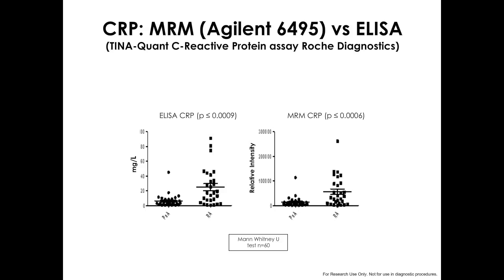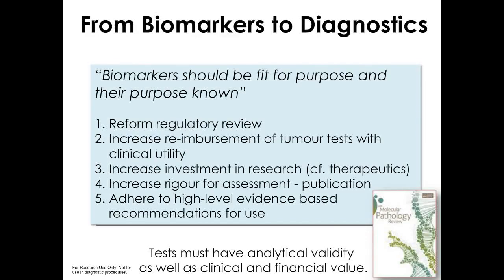And so if we want to take biomarkers from something we've discovered in the research laboratory to a clinical test, to a diagnostic, then I think it's evident that the biomarker should be fit for the purpose for which we intend it. And of course, we need to know that purpose. And this reiterates the start at the end principle.